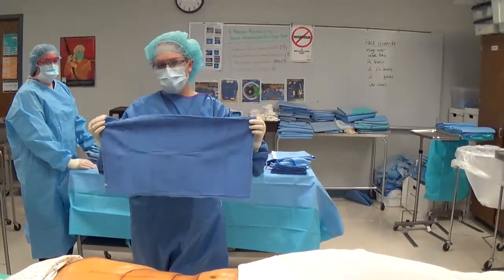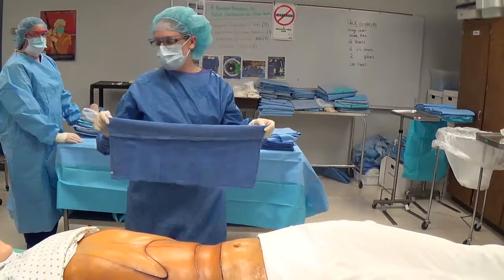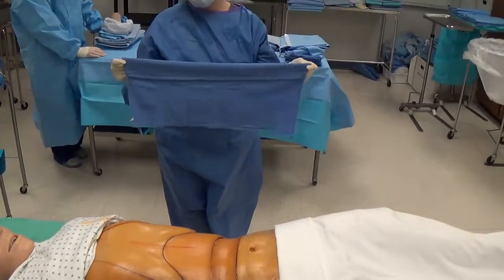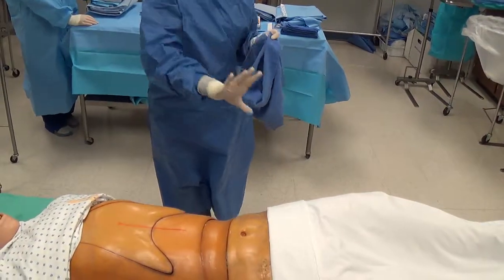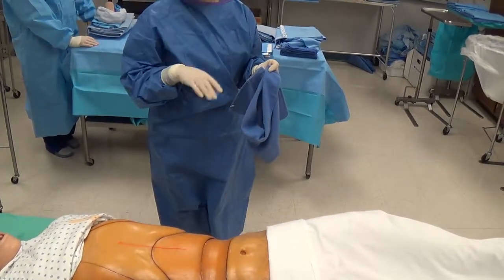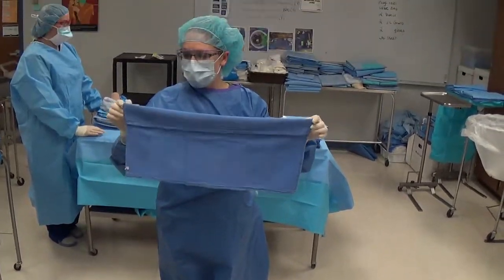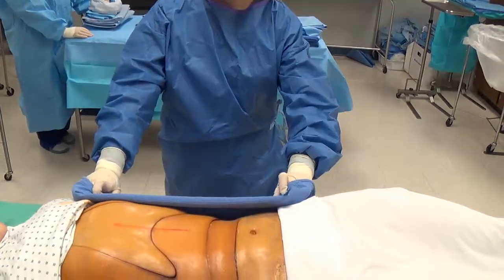When we place the square-off towels, remember you open a blue towel all the way, make about a two-inch fold away from you, and on the first one you need to cuff your hands so they're protected from any unsterile areas on the outside. We always place the towel in front of us first because we're sterile and want to establish a sterile area. Open up that towel, make the two-inch fold away from you, cuff your hands, and then approach the field.